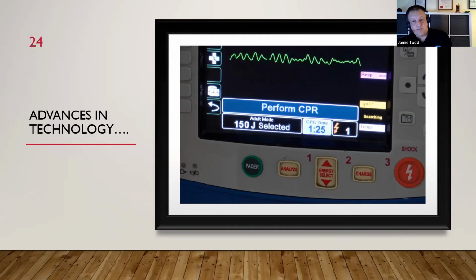then the Zoll also knows shockable rhythm, because although it's in manual mode, you can still select energies and press charge and whatever. But if you tap the analyze mode, it's already looking at the rhythm. In fact, it'll be shouting at you, going VF alert, VF alert, VF alert. If it sees VF, it actually tells you, in case you're not looking at the screen.